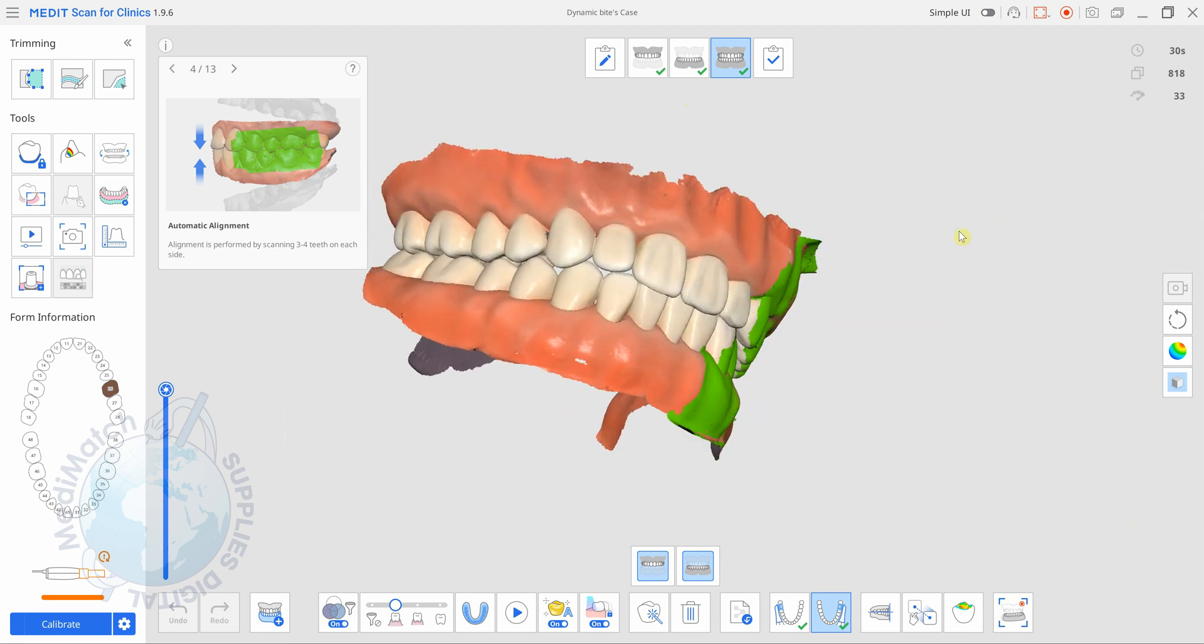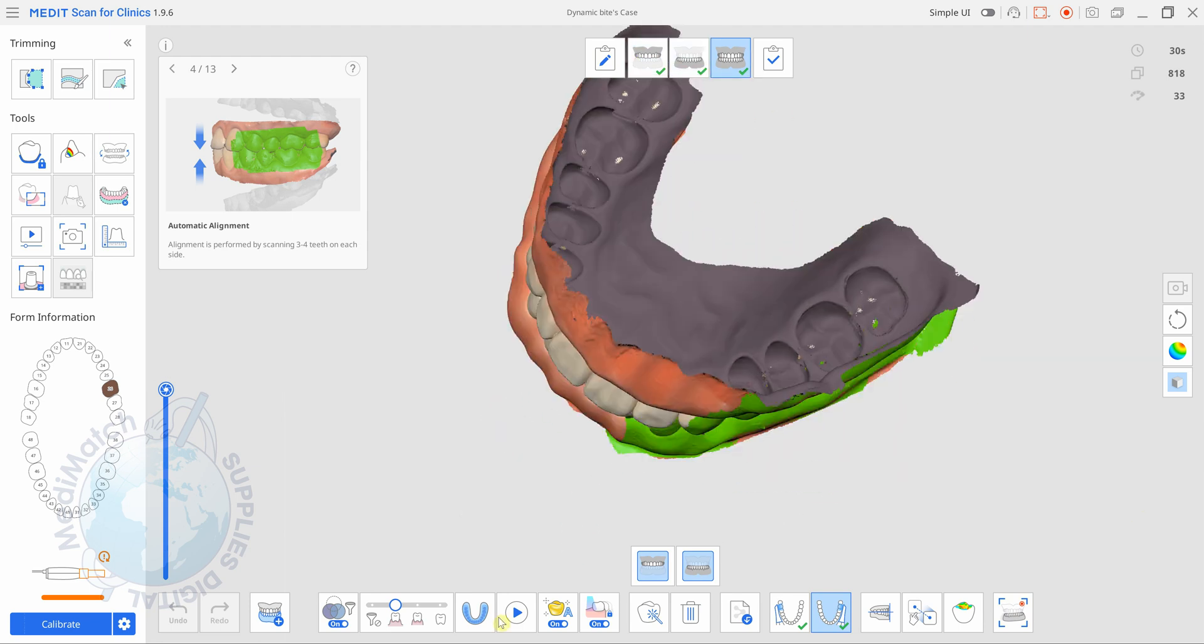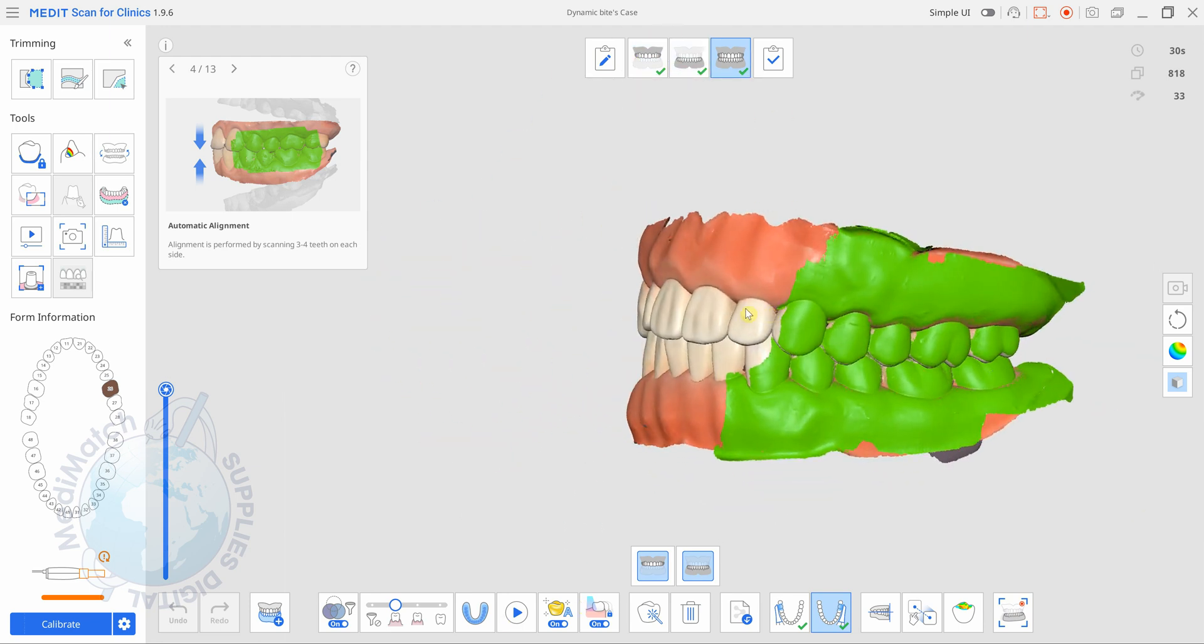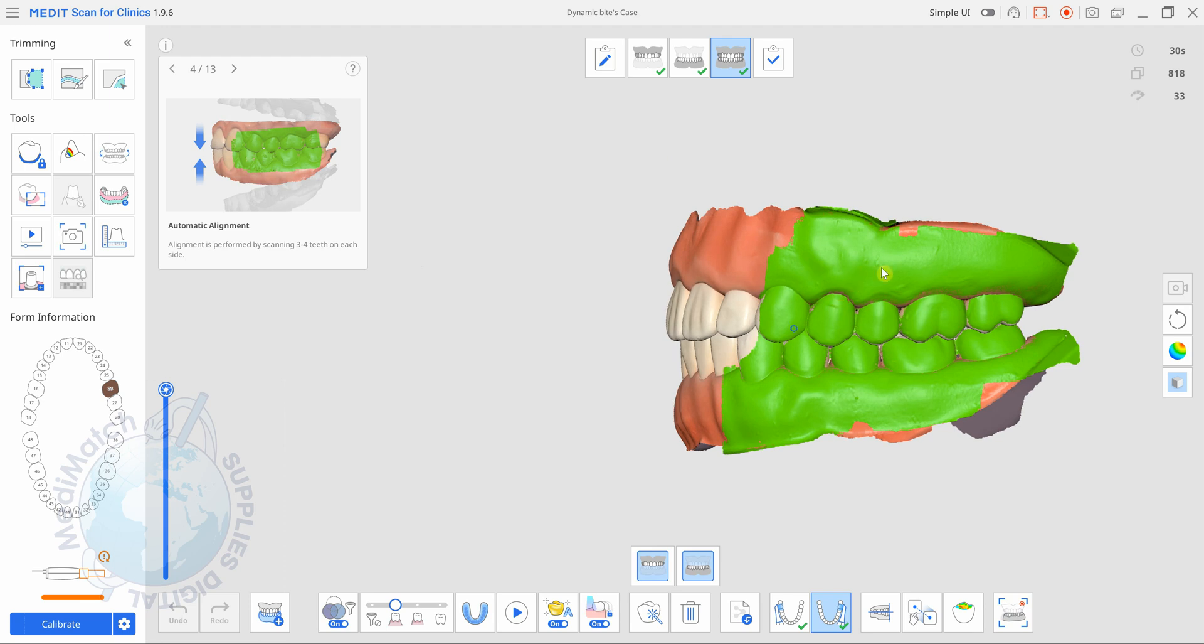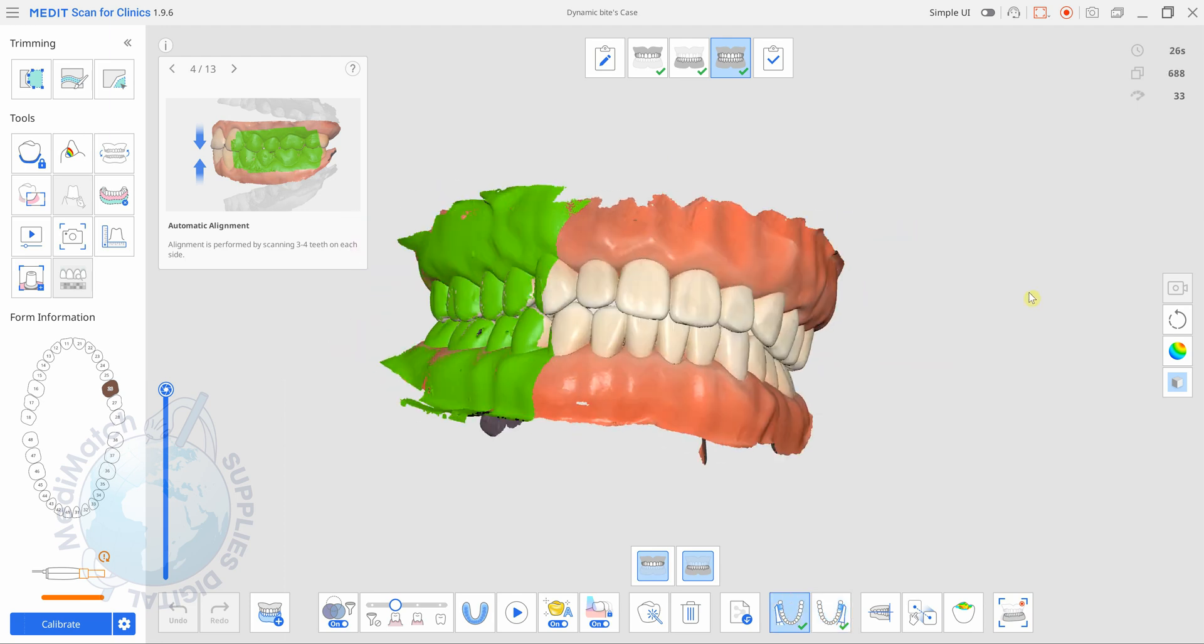As you can see here I've got scanned in my upper and my lower and my bite is normal. I've captured a good amount of soft tissues on the buccal faces of the posteriors on both sides of the bite.